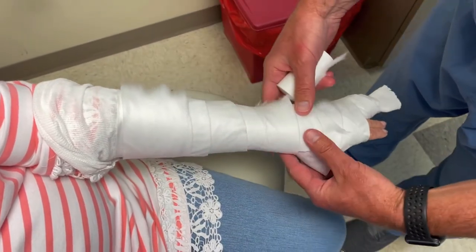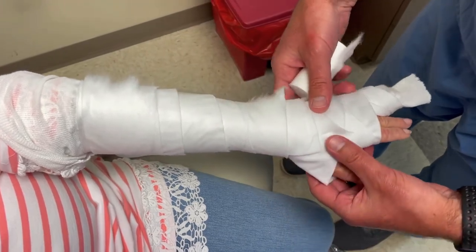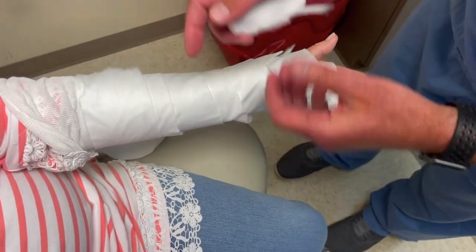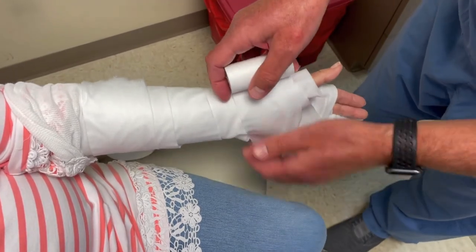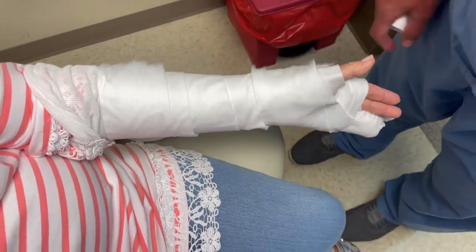Usually two or three thicknesses is plenty for ortho glass because it has padding built in. So that's your final product. If you see little openings you can pad it just by doing this — you don't have to go around and around. And that's it.